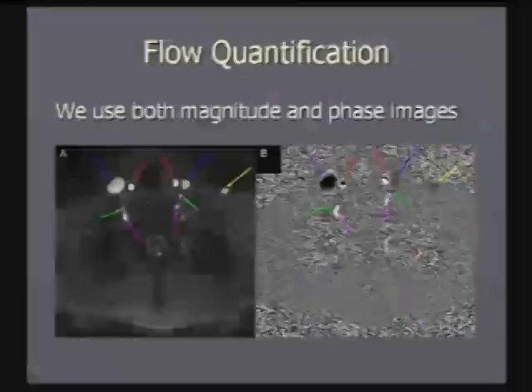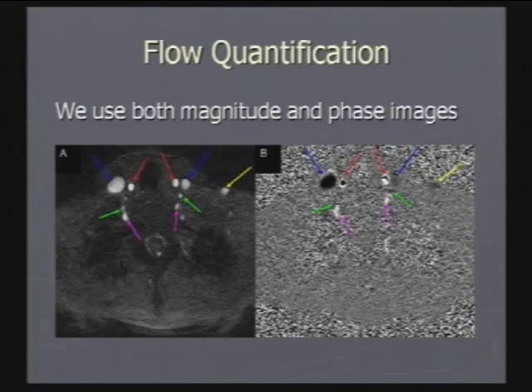Now I want to point out to you that I think ultrasound is important. I think ultrasound will help you look at the valves and the valvular function, but I don't think ultrasound is as good as MR in giving you 3D information. I don't think it's even as good as MR in giving you flow quantification. So I want to show you an example of how we do flow quantification in MR.